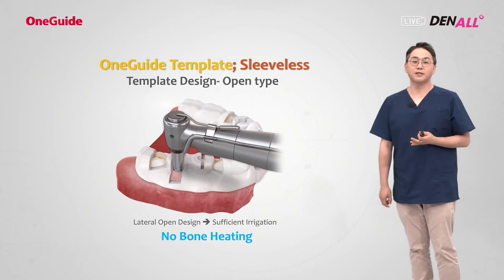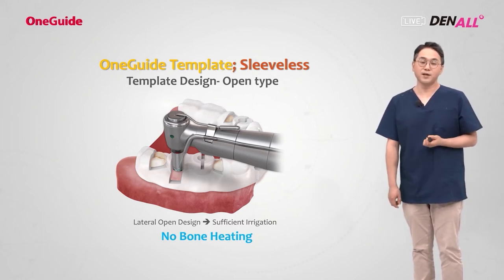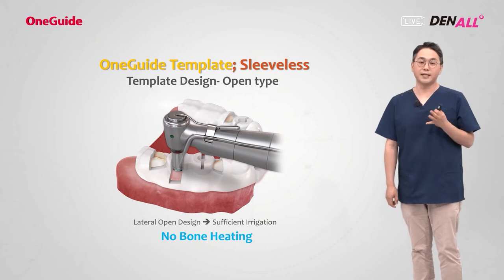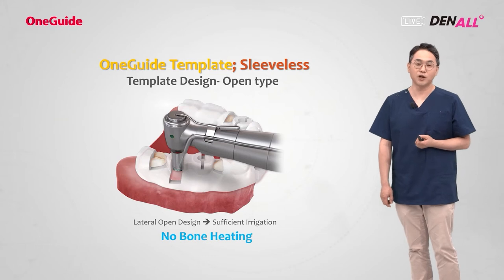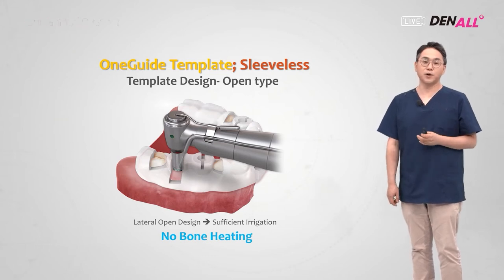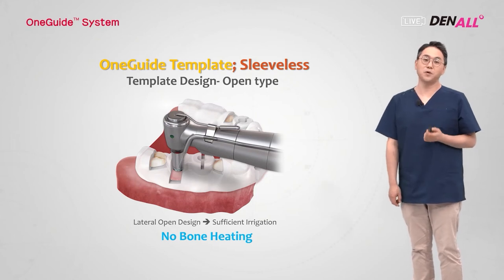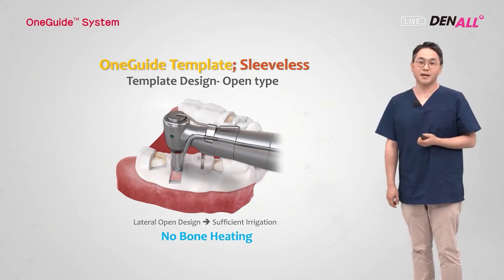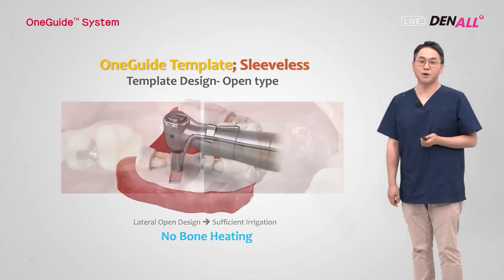The guided system can cause thermal damage, and this can be reduced because a lateral open system is used. Through the opening, sufficient irrigation can be done. When the bone is expected to be hard, copious irrigation can help.